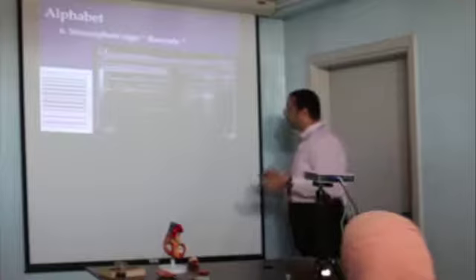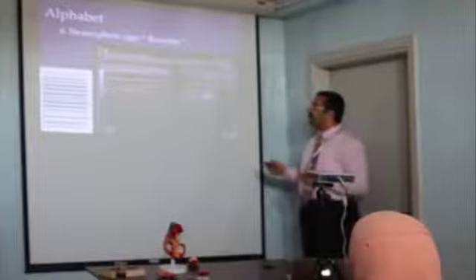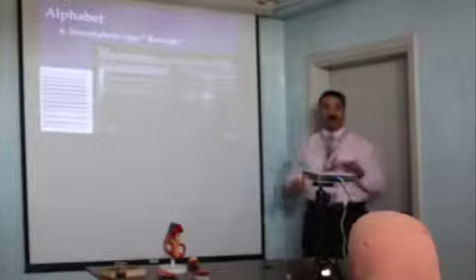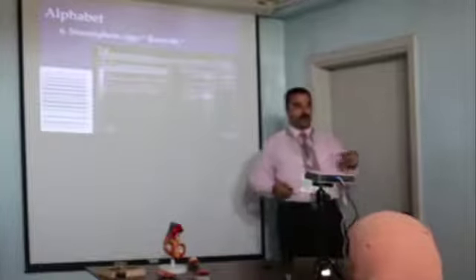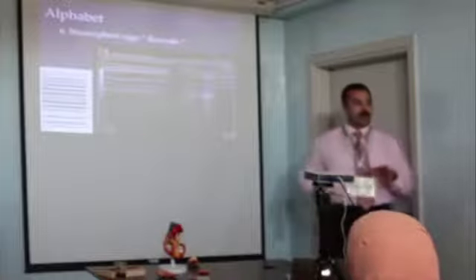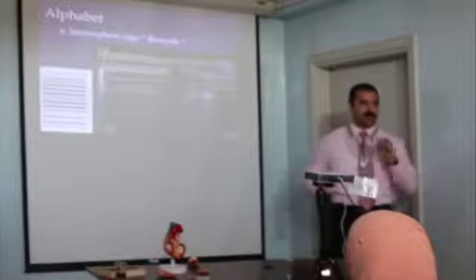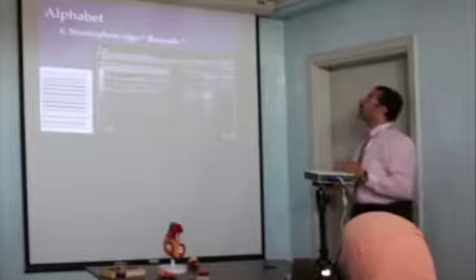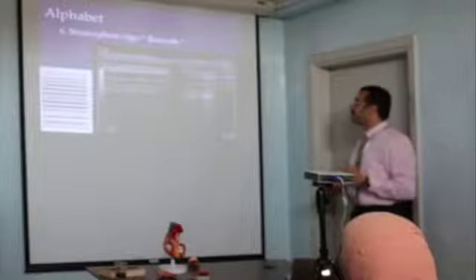But when you get the barcode sign, everything becomes lines, lines, lines. This is possible pneumothorax. All I know from this barcode sign is that the lung is not moving in the right way. Maybe the patient is apneic or whatever the underlying cause. We call it barcode sign or stratosphere sign.